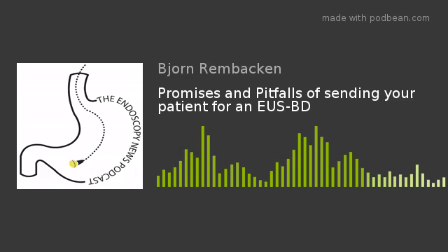In essence, an EUS-guided biliary drainage procedure from the duodenum is just a high pre-cut fistulotomy. And so if you look at it that way, and especially the fact that it can take as little as 5 minutes, I think it's pretty clear that it's probably going to be favourable above a rendezvous.